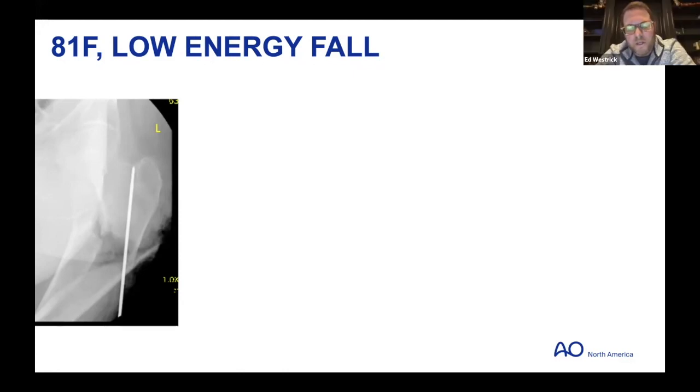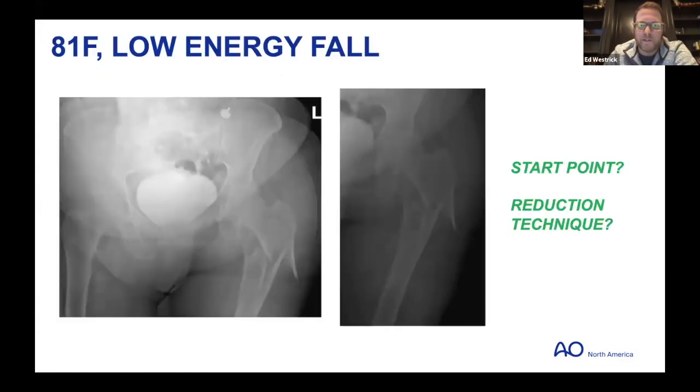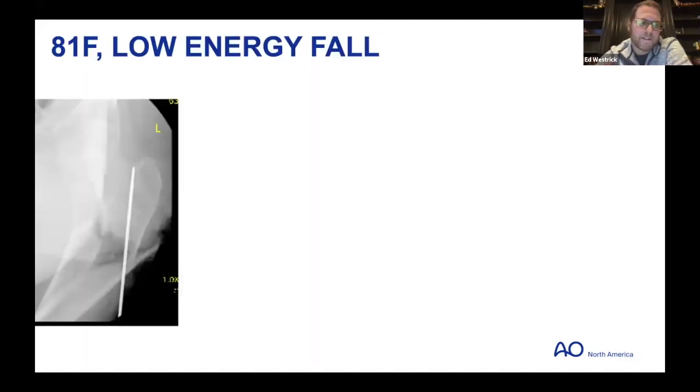Well, so my worry was actually the opposite. I was more worried about the shaft, and so I don't have all the images. You don't really need a CT scan, but here, this is really just the head neck segment proximally and a spiral distally. And so we'll have a contrasting case coming up to show exactly what you're talking about. But I think for this one, controlling the head and neck segment could be done through percutaneous techniques, Shantz pin, different types of manipulative wires and whatnot.